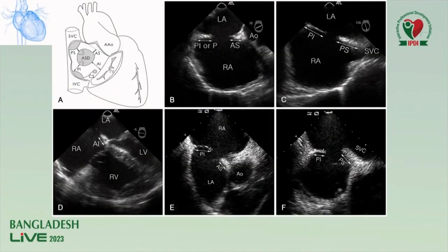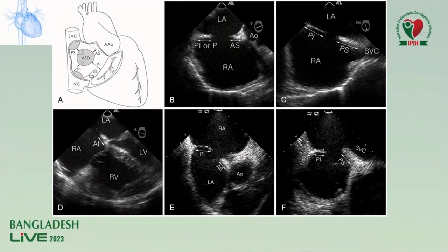These are different TEE views showing ASD and its rims. The aortic rim and SVC rim are visible, as is the IVC rim. The 4-chamber view shows the AV valve rim. In the short axis view at 30 degrees, we can identify the aortic rim, posterior rim, SVC rim, and IVC rim.